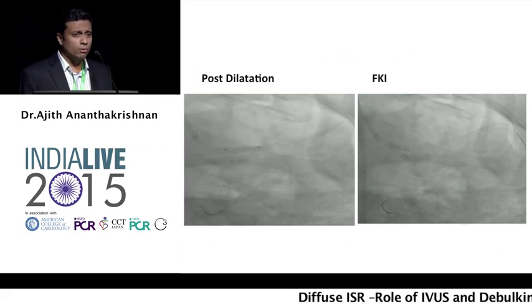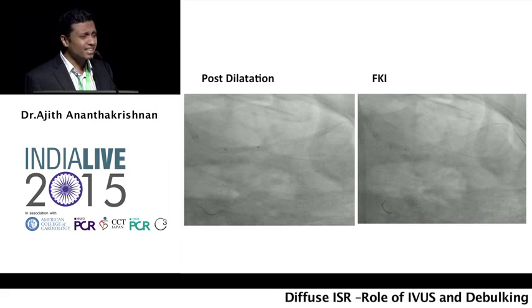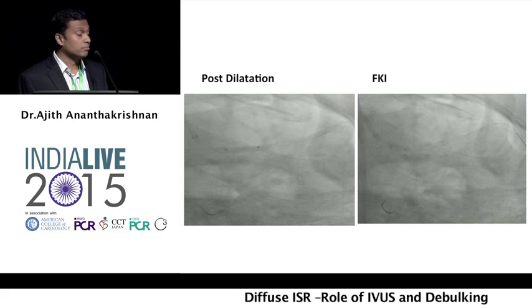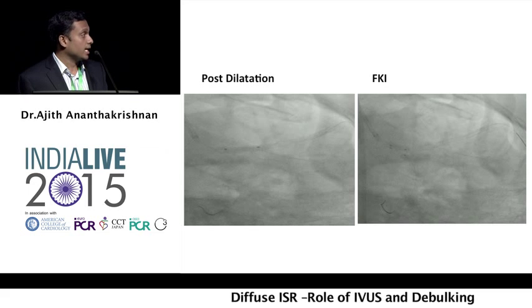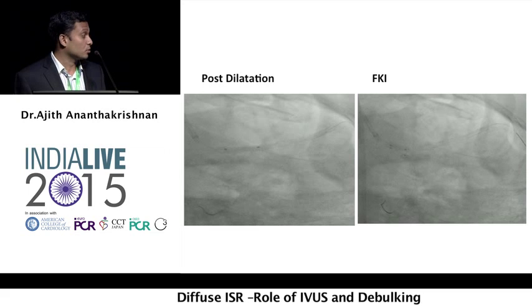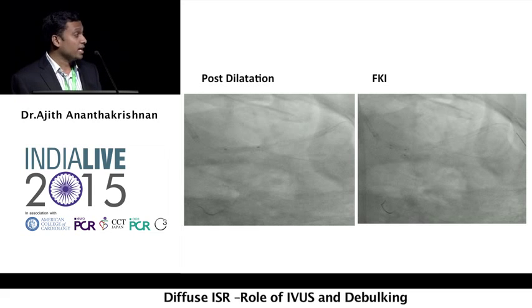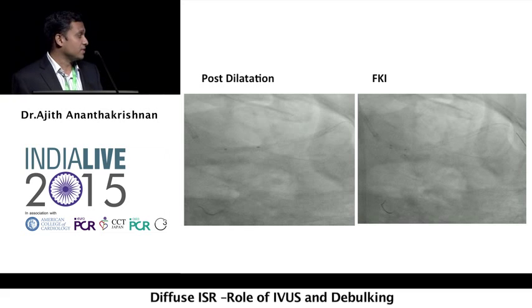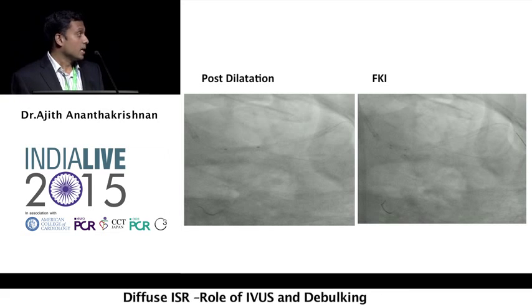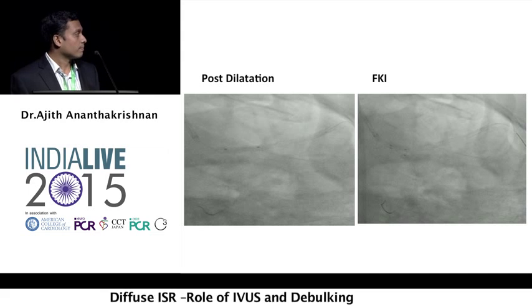We followed up with a 4 and 4.5 mm post-dilatation, aggressive post-dilatation actually, because that area was not yielding properly. And then we followed up with the 3.5 in LM to LAD, and then 3 mm LM to circumflex final kissing inflation. Circumflex dimension, according to IVUS, was 3.2 mm, so we used a 3 mm balloon. Our idea was not to stent the circumflex because, as we saw, there was not much plaque burden in the circumflex. We just wanted to open the struts, and hence we used a 3 mm balloon.